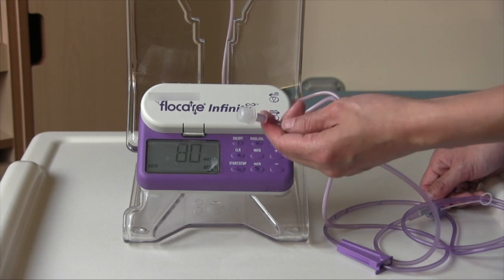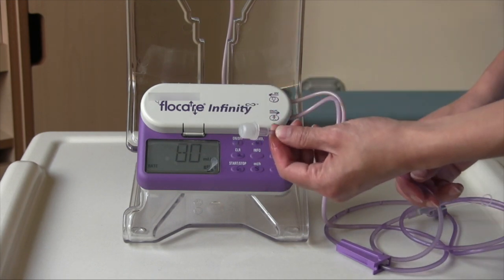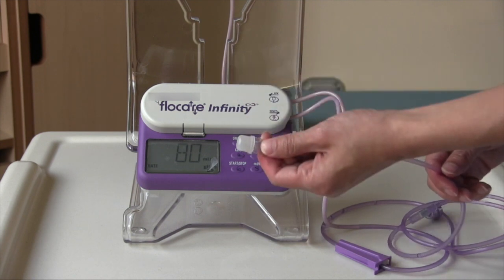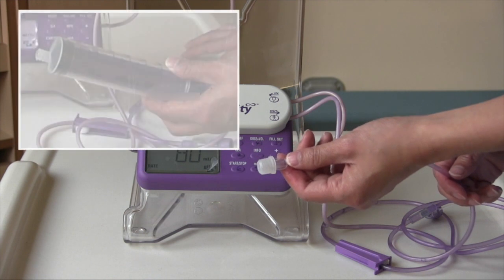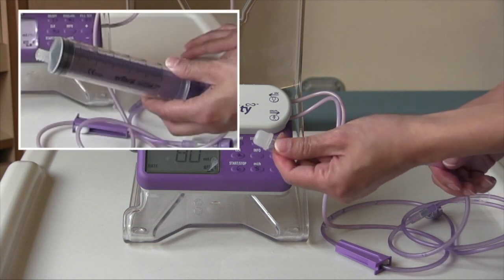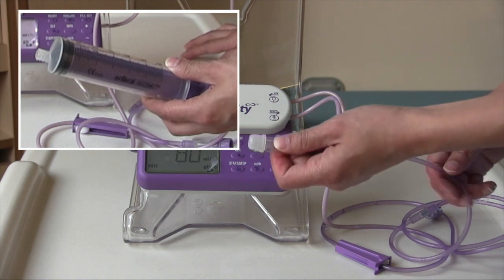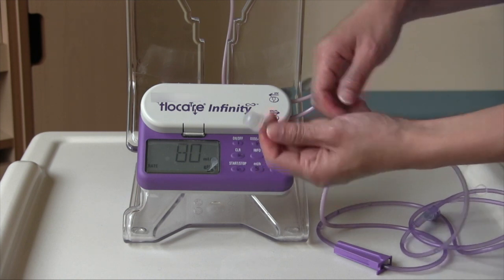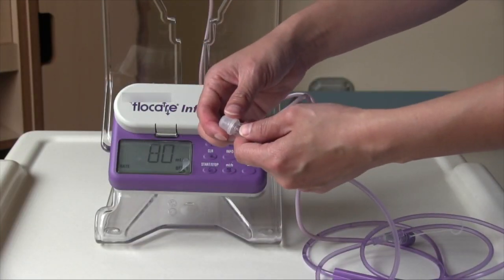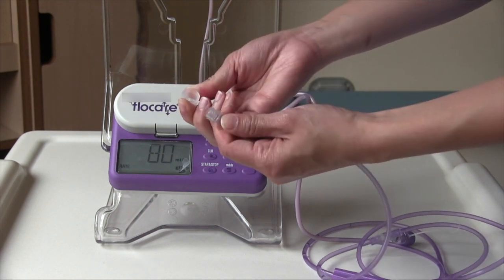Once your giving set has been primed or the air is out of your tube, you can now connect the end to your feeding tube. Before you do this, you'll want to flush your feeding tube with water. It's important to do this to prevent blocking of your tube and to rinse out any previous sediments. To take the cap off the end of the tube, you simply squeeze, twist, and pull.